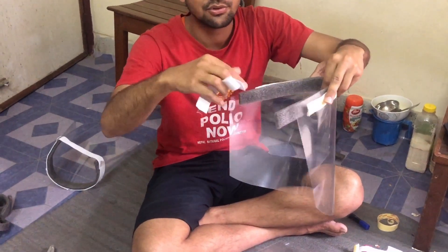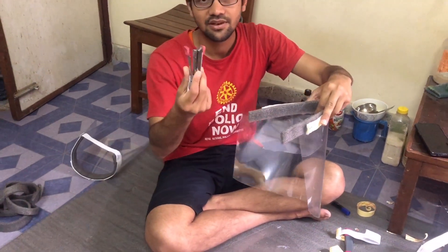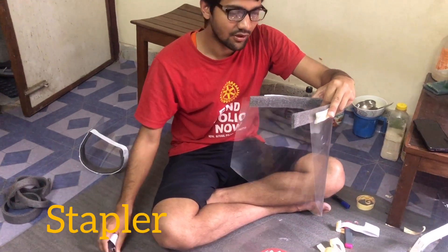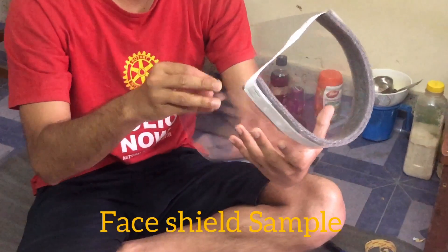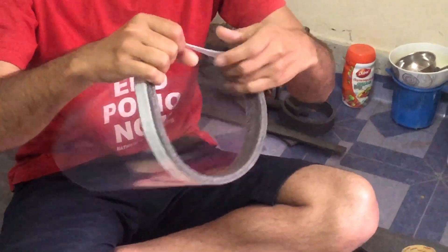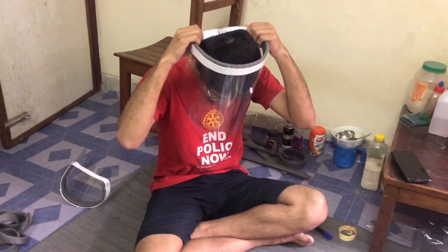If you want to make it stable, you will need to work on it so you will be able to make it better.